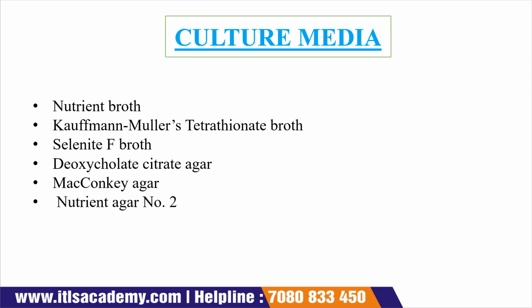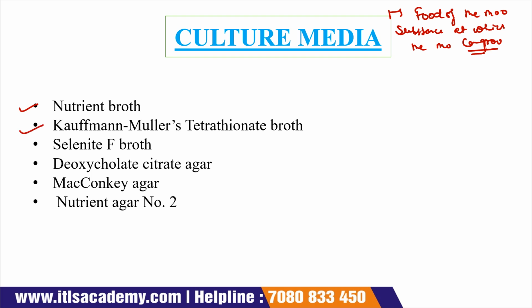Now the next is your culture media. Culture media means, in simple words, the food of the microorganism, or you can say the substance on which the microorganism can grow. So here we use different media: nutrient broth, Kauffmann Muller tetrathionate broth, selenite F broth, deoxycholate citrate agar, MacConkey agar, and nutrient agar number 2.